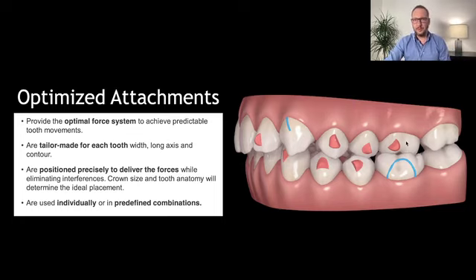These are very close one with the other, but they have different shapes here, completely personalized for the movement that we want to promote here, okay? So it's like comparing, you are going to buy a suit, you can go to Zara and buy one that is there, or you can do a tailor-made for you specific with your measurements, okay?